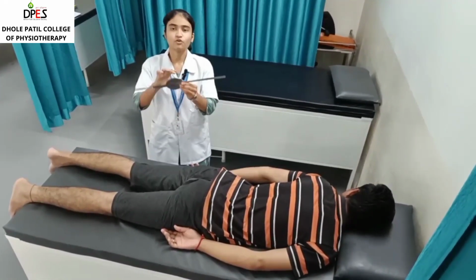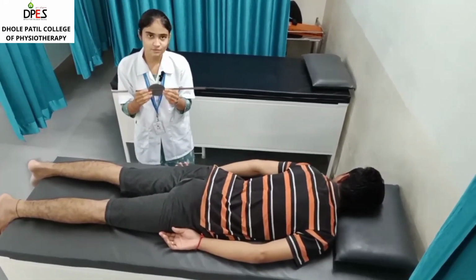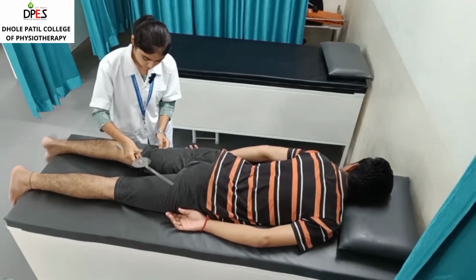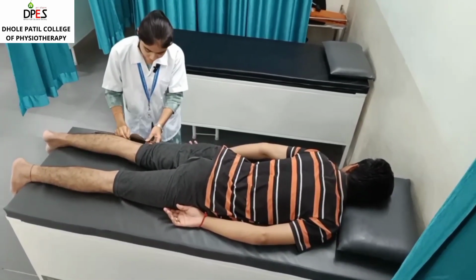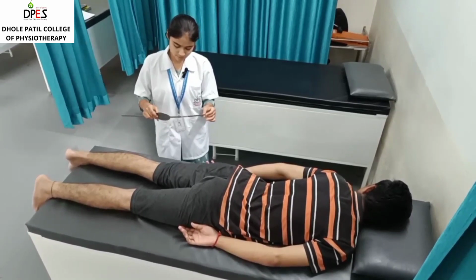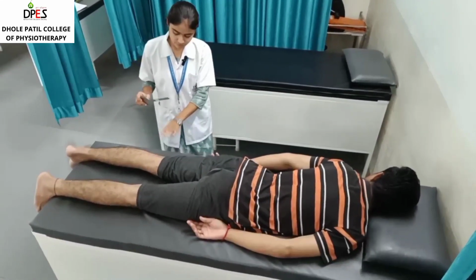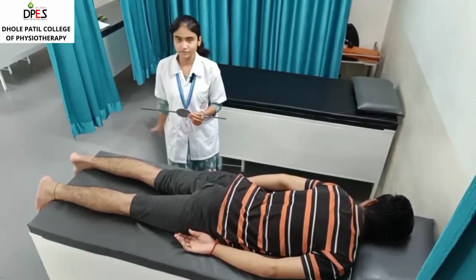This is the body of goniometer. This is the fixed arm, which is also known as proximal arm, as it will be placed proximally. This is the moving arm known as distal arm. The fulcrum of our joint is the lateral condyle of femur, and the proximal arm, which is the fixed arm, will be placed along the imaginary line joining the greater trochanter and the lateral condyle of femur, and the distal arm will be joining the lateral malleolus of the fibula.